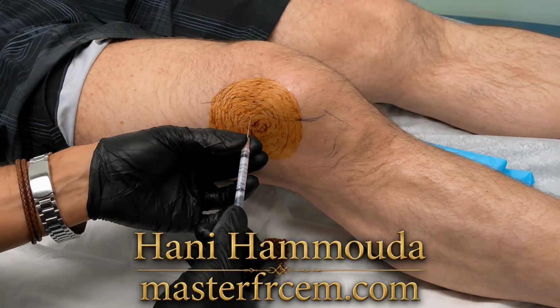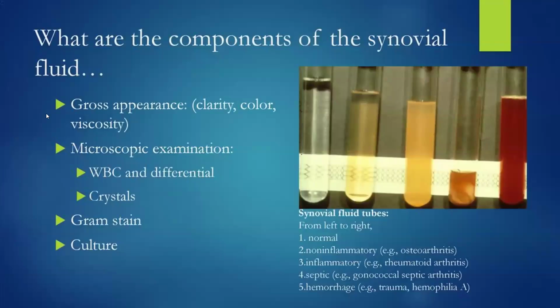Now, after taking the fluid, you put it in the tube, send it to the lab. You're going to be looking out for gross appearance, like clarity, color, viscosity. You're also looking out for microscopic examinations, white cells and differentials, crystals, gram stains, culture, etc. Don't forget to dress the area that you've aspirated. And don't forget to dispose your sharps into the sharps bin, and the other materials into the yellow bin. And then your working diagnosis depends on the history. And after looking at the color of the fluid, that gives you an idea of what you're thinking about. Do you understand?